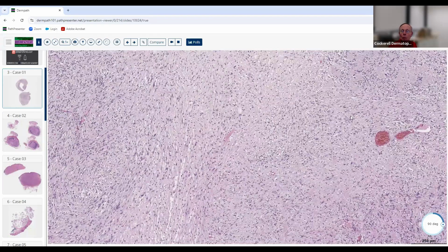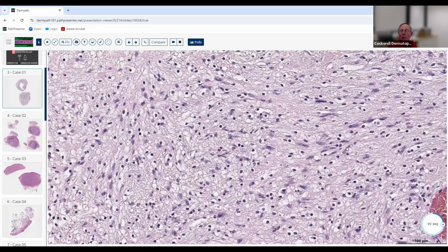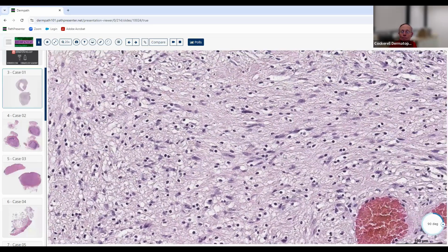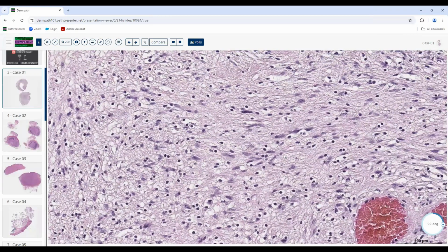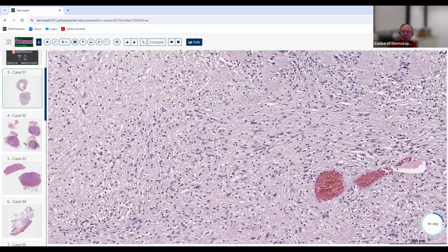Good. If it were muscle, what do those nuclei look like in a muscle neoplasm? I think more like a cigar. Yeah, good. They're rectangular, more kind of blunt. They look like a cigar. They don't really look like they're sort of fish swimming nice and lazily through this nice sort of sea of fibromucinous stroma here. And then the last one are the fibroblasts and histiocytes.